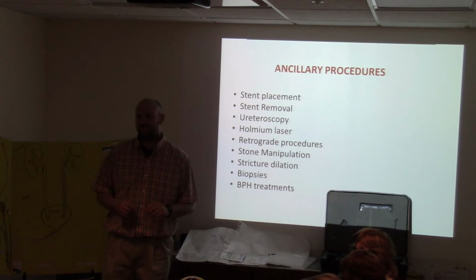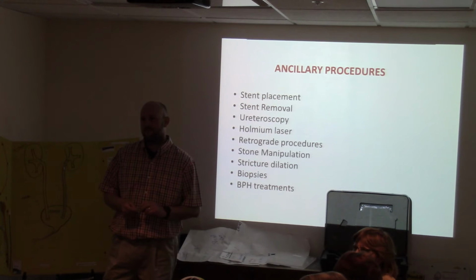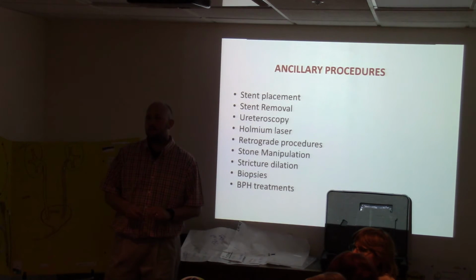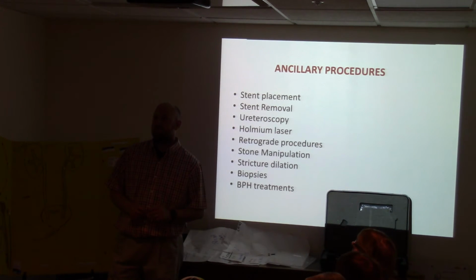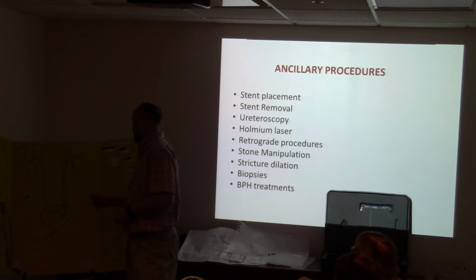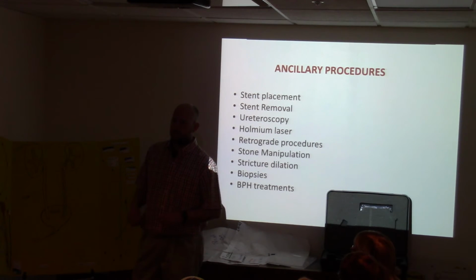You mentioned the hematoma, so why would the doctor determine that he would do it bilateral? Like, would there be a health reason, like a healthy person, they would determine that I can go ahead and do that? Healthy people can get hematomas. Actually, if you did a CAT scan after every lithotripsy, every single patient who had a lithotripsy would have a hematoma of some sort, some degree. It could be a tiny one, but they would have some because the tissue just gets bruised and it bleeds.